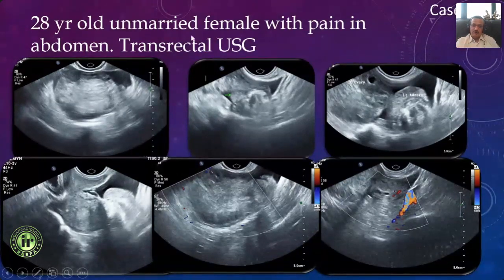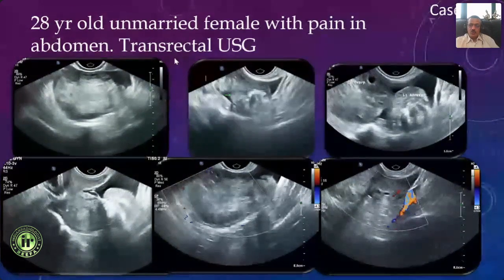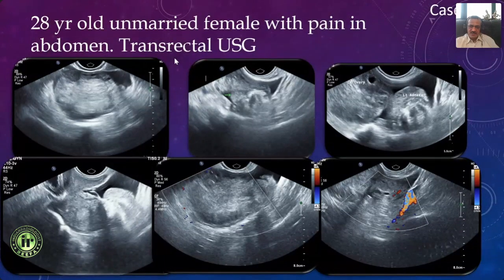So in this situation, always do a transrectal ultrasound. Jyoti just put in a probe, and we can easily see the whirlpool. That's very diagnostic. That's the whirlpool sign, which Dr. Bhupati has written about, which we were seeing, but we never wrote about it. And that's a very large ovary with no follicles and no color flow. So the teaching point here is, if you're suspecting congenital malformation or anything like this in the pelvis, do not hesitate to do transrectal. It is as good as transvaginal ultrasound. And of course, we need to have small probes, which most of us have nowadays.